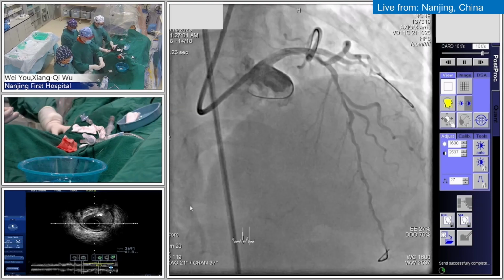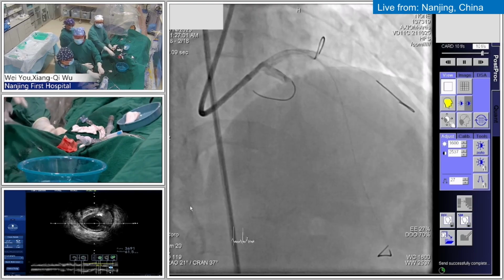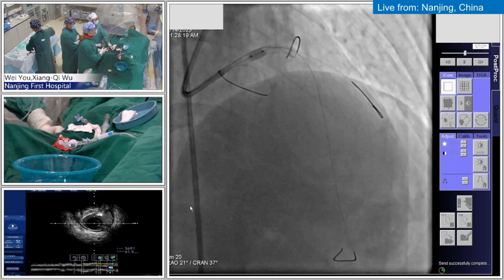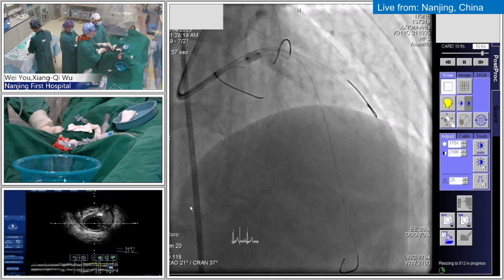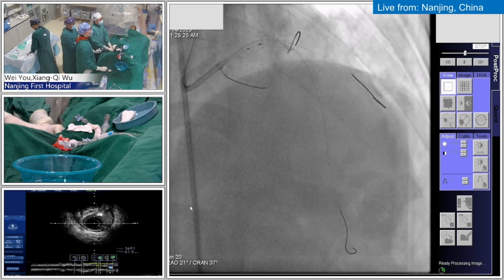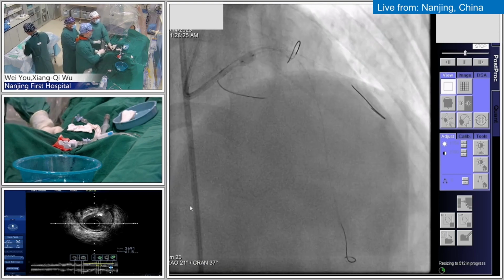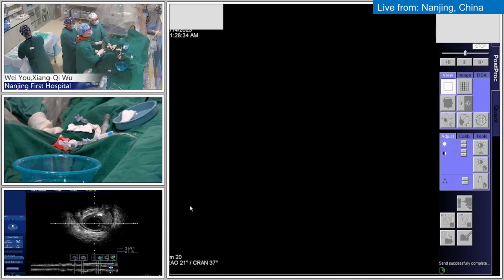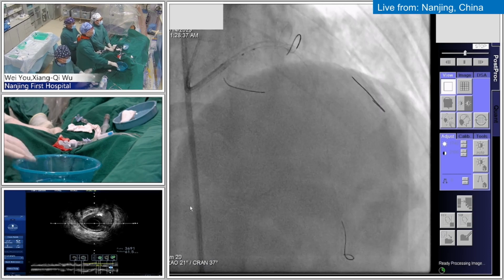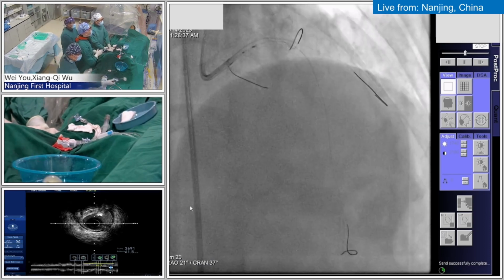segment. Give me a 4.0 balloon. Chinese. Is this Professor Chen's short 15, 16 balloon? Yes, Professor Chen's short balloon, just designed for the POT, with no shoulder, length 16. Okay, done. With the length 16, it's very suitable for the POT.